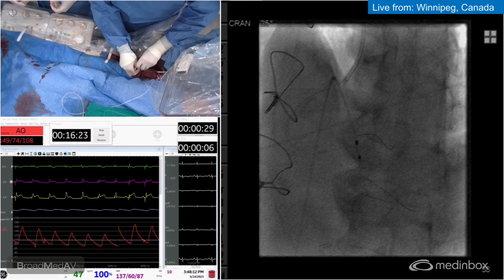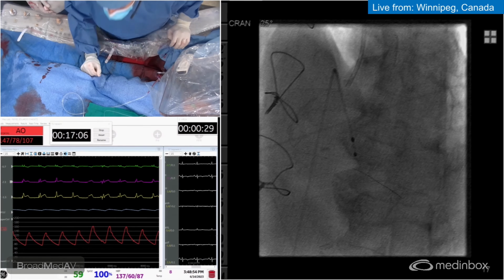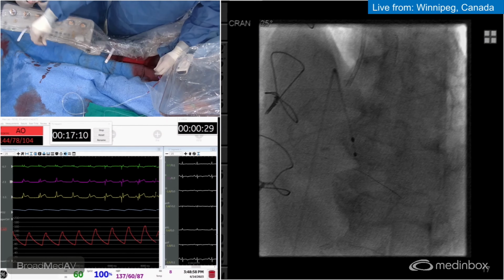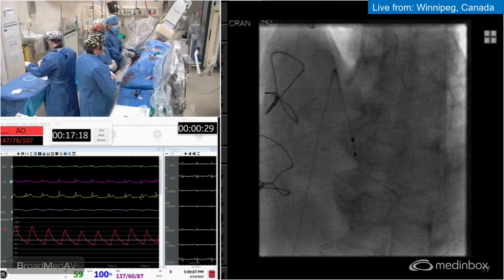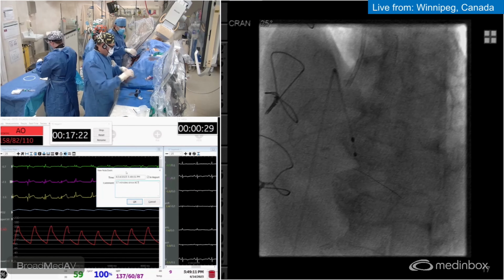Just to simplify things here, we've got a wire down the vessel already. So on the monitor, the STs are coming down. We've got good flow. We've opened up the PDA. We've done a run with 80 kRPM on the orbital. It wouldn't crack, although it became a crossable lesion. We dealt with the first problem, but we now had an undilatable lesion. So our approach there was to do another run with orbital at 120.